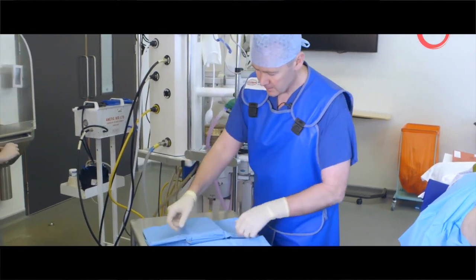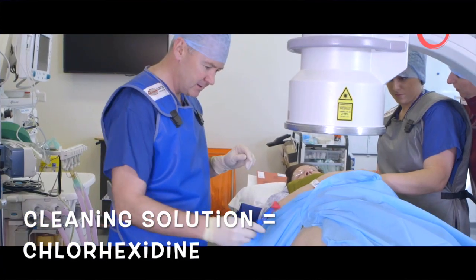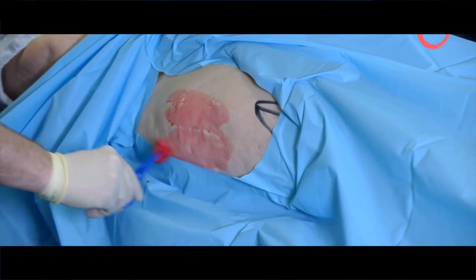We prepare the skin, so we use a cleaning solution to actually sterilize the skin as best as possible. Your leg, is that okay? So it's always colder than we might think. We then introduce some local anesthetic in the skin.